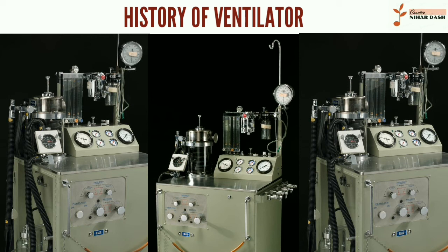Its principle of operation was very simple. An incoming gas flow was used to lift a weighted bellows unit, which fell intermittently under gravity, forcing breathing gases into the patient's lungs. The inflation pressure could be varied by sliding the movable weight on top of the bellows. The volume of gas delivered was adjustable using a curved slider, which restricted bellows excursion.